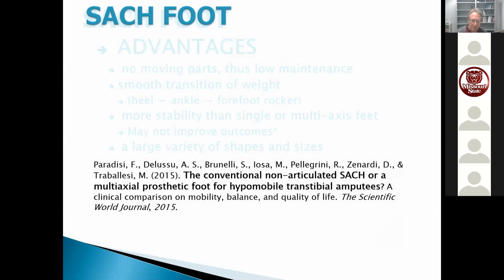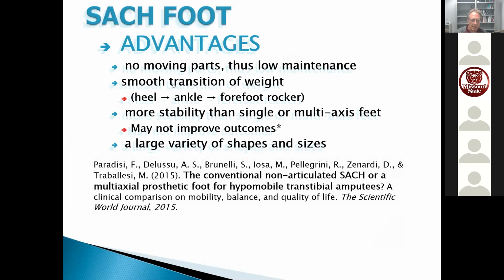Okay, so I'm going to just share this here. These are some advantages of the SACH foot, and you guys can all read as well as I can. But I do want to describe something that's kind of interesting.